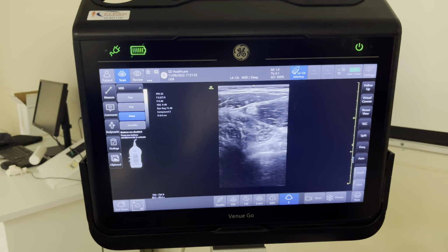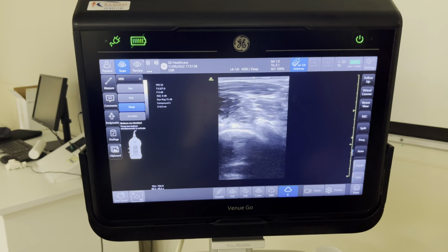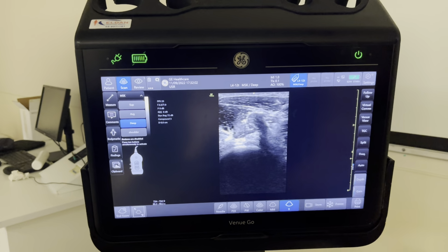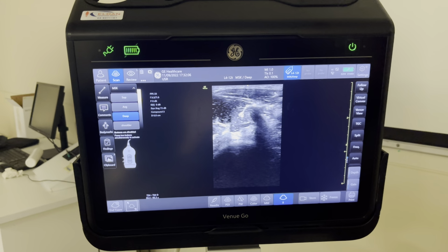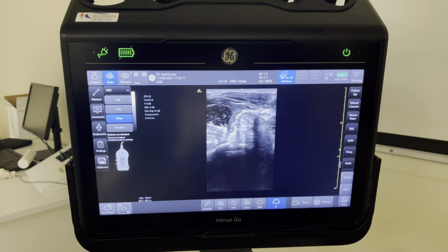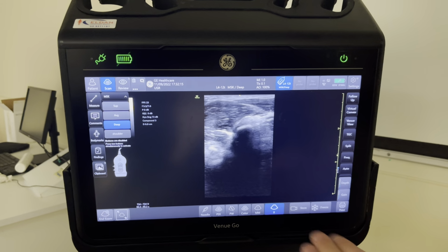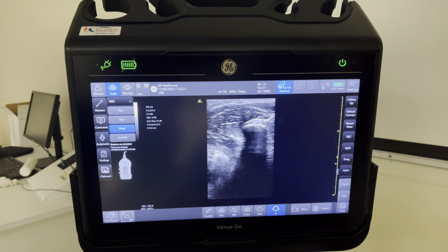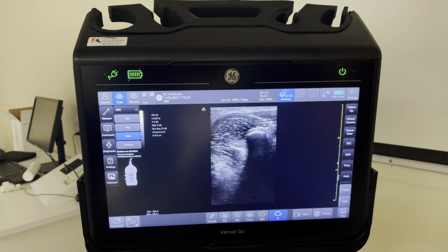So up we go. The size of the muscle decreases, it lowers itself a bit. There's the first shadow, but there's no hyperechoic line. So this is because of the indirect tendon of the rectus femoris. If we go up, the shadow might become a bit less. And if I continue to go up out of the deep, another hyperechoic line appears, which is the anterior inferior iliac spine with the rectus insertion on top of it.